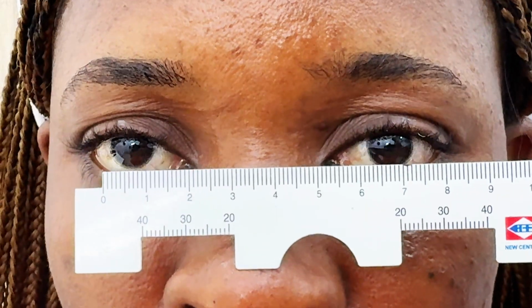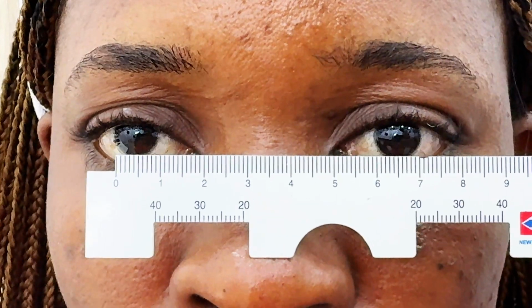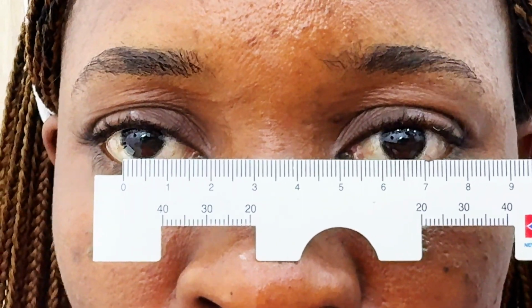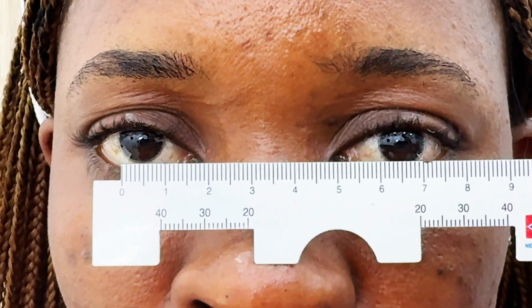Okay. So the next method is to measure from limbal margin to limbal margin. Now I'm going to use her right temporal limbal margin, and then I read it off at the left nasal limbal margin. The same method, I close my right eye, direct my patient to look at my left eye. I place the zero mark at the right temporal limbal margin, and then I close my left eye, direct my patient to look at my right eye. Now I read it off at exactly my patient's nasal limbal margin.